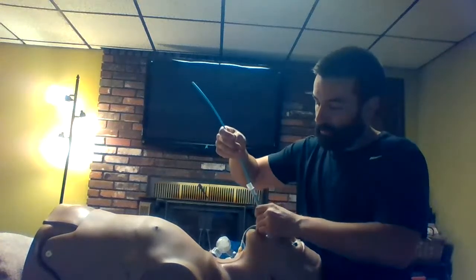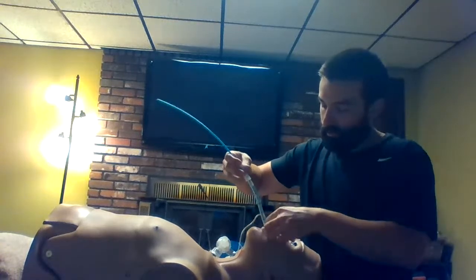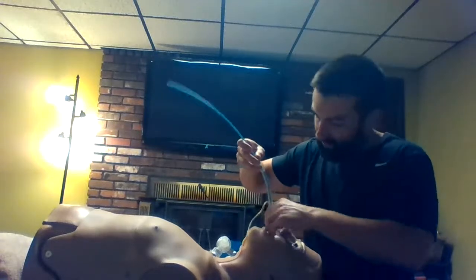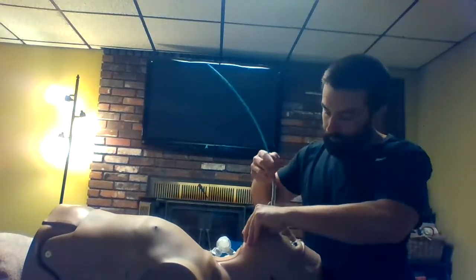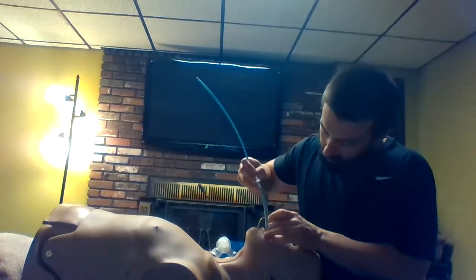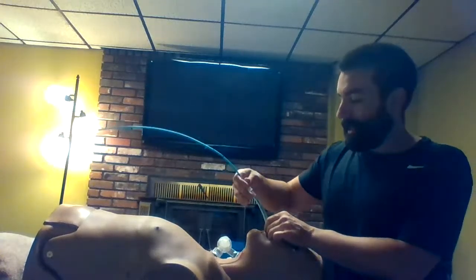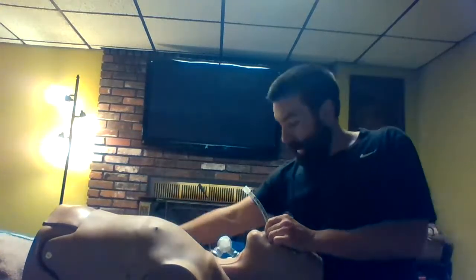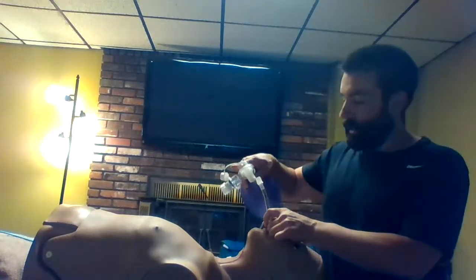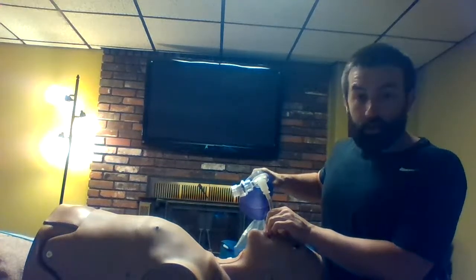I should have lubed this thing up a little bit better. Don't have any lubricant here at the house. Okay, I'm about 21. I don't know if that thing slid in or not just because it's getting hung up. Go ahead, hold the bougie, hook up. Got chest rise.